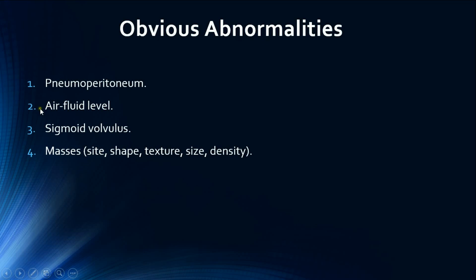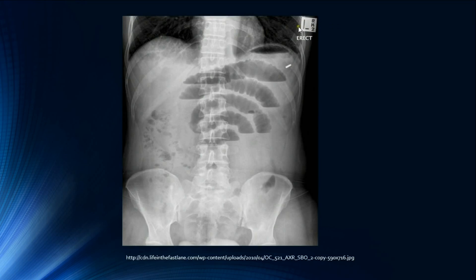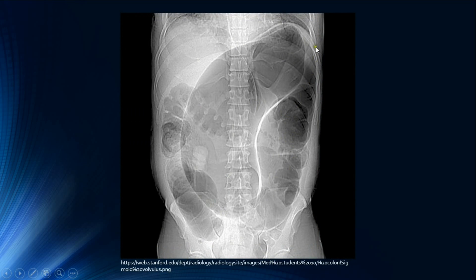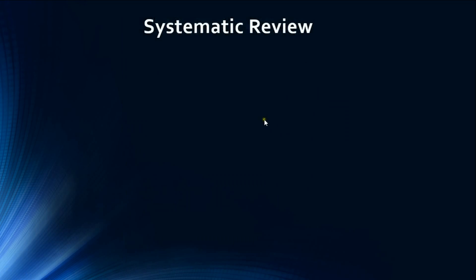Next, look for obvious abnormalities such as pneumoperitoneum, air-fluid levels, sigmoid volvulus, or masses. However, findings on abdominal radiographs are usually subtle, so systematic review is essential. Here is an erect AP radiograph showing dilated small bowel with valvulae conniventes and multiple air-fluid levels indicating small bowel obstruction. Here is an example of sigmoid volvulus showing the classic coffee bean sign.